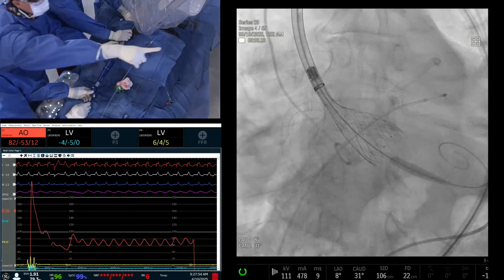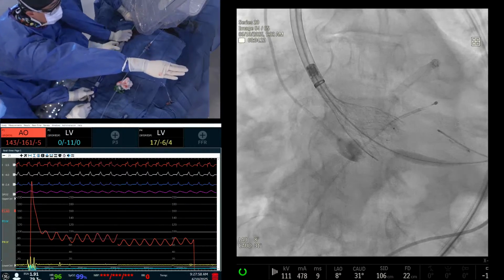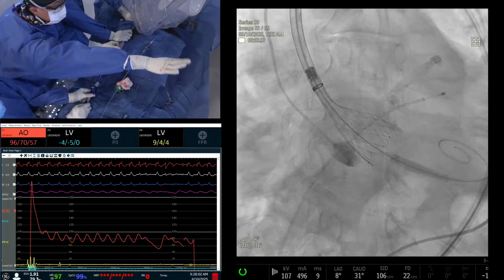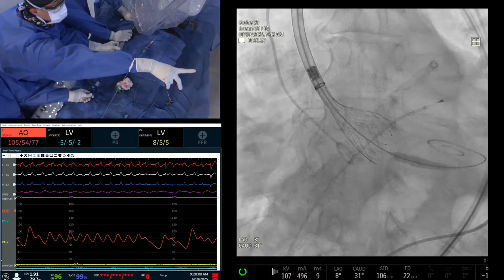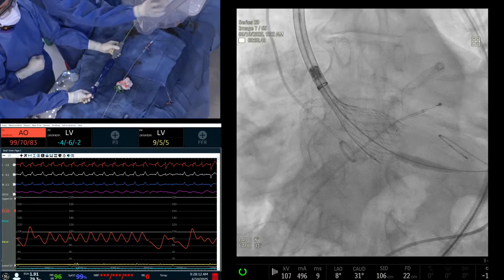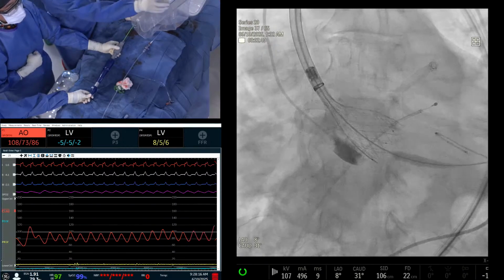That's good. So this is very important for the audience. The contrast is only in the sinus space. There's calcium at the base. That was why we talked about it earlier. So it's actually shallower than you think. Let's take a breath and show that again. So you can see it's around 4 and 6. It's a big root, so you have to be really careful: fill up with the dye and then stop. Yeah, right there.